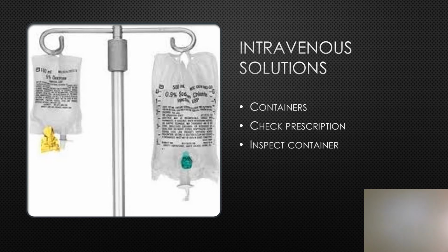Cross-check that solution with the order or a medication administration record, and follow the medication administration rights. Inspect the solution container to make sure it's free of floating particles, that it's not discolored, not expired, not cracked or leaking. If any issues are discovered, don't use it and return it to the pharmacy because they may be able to receive a credit from the vendor.